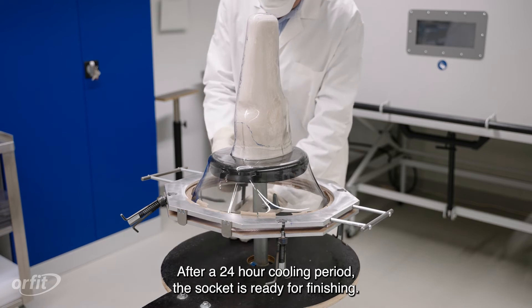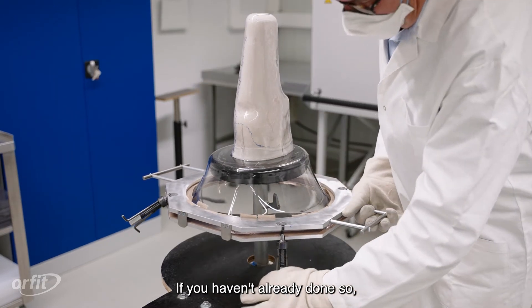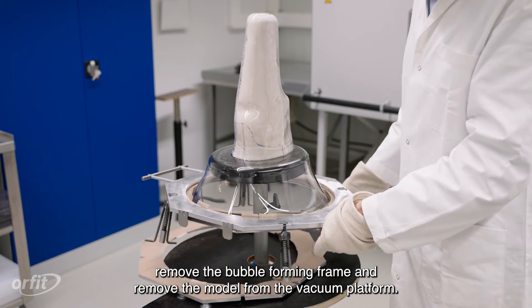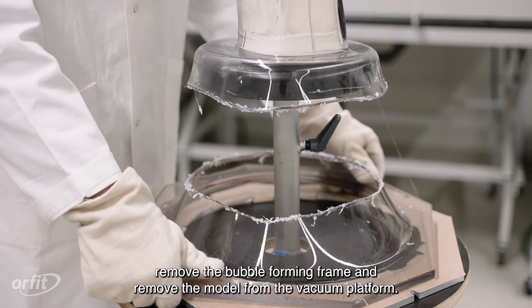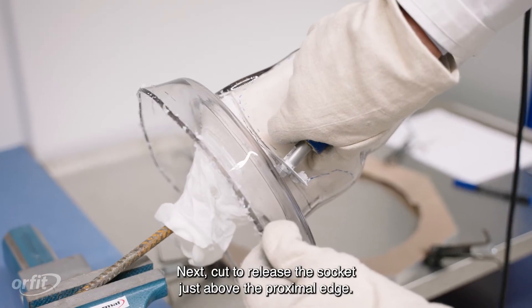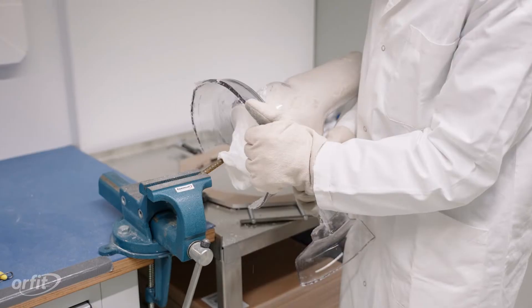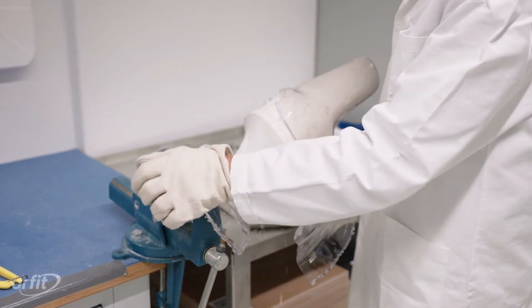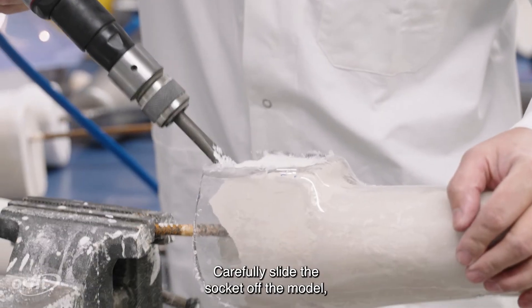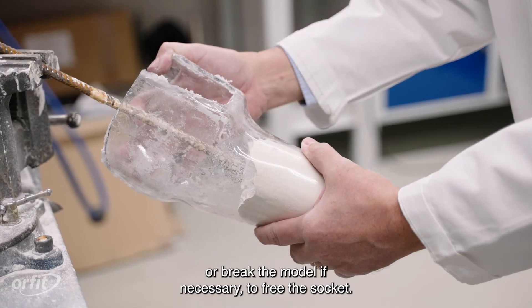After a 24-hour cooling period, the socket is ready for finishing. If you haven't already done so, remove the bubble-forming frame and remove the model from the vacuum platform. Next, cut to release the socket just above the proximal edge. Carefully slide the socket off the model, or break the model if necessary, to free the socket.